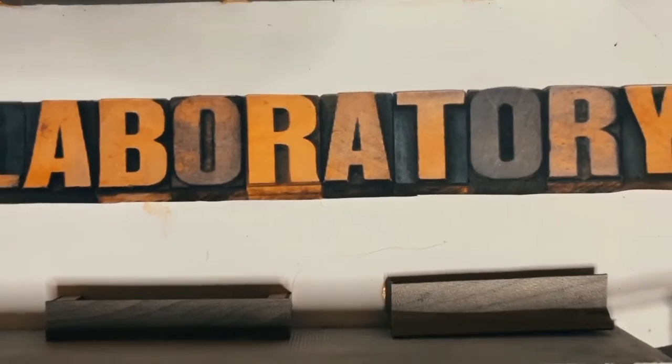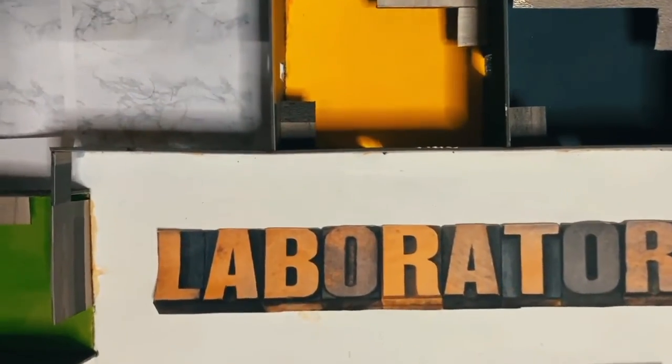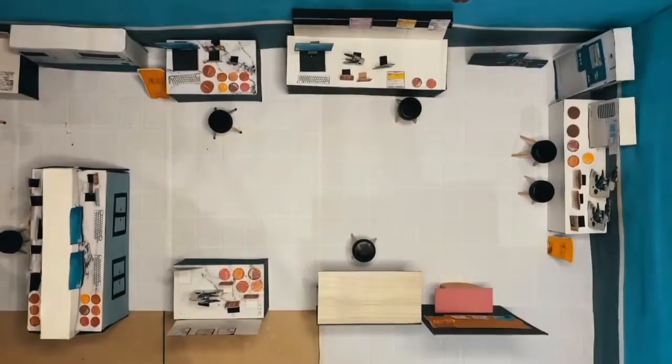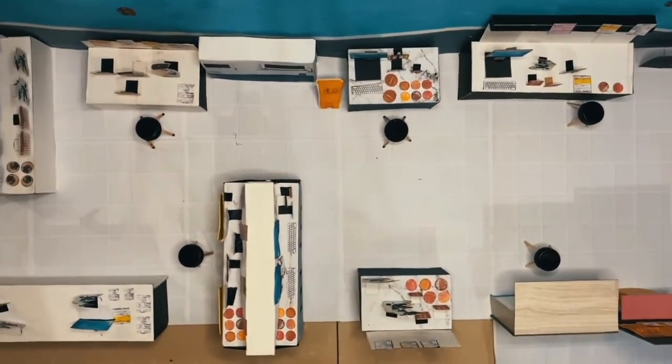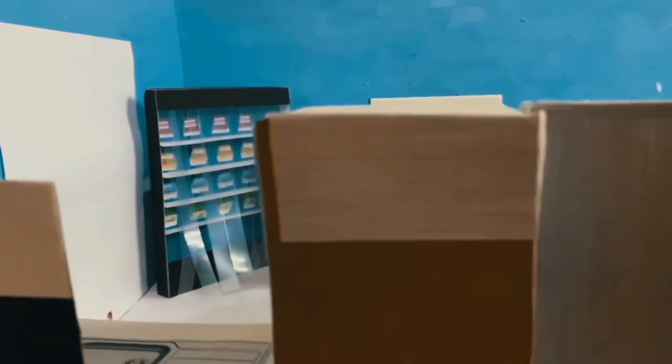The clinical microbiology laboratory plays an important role in patient care by providing the cause of infection and antimicrobial susceptibility data to physicians. Rapid diagnosis of pathogens is important for initiating effective antibiotic administration and improving the outcomes of treatment.